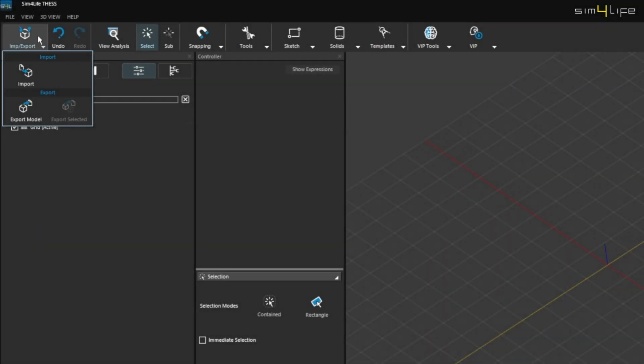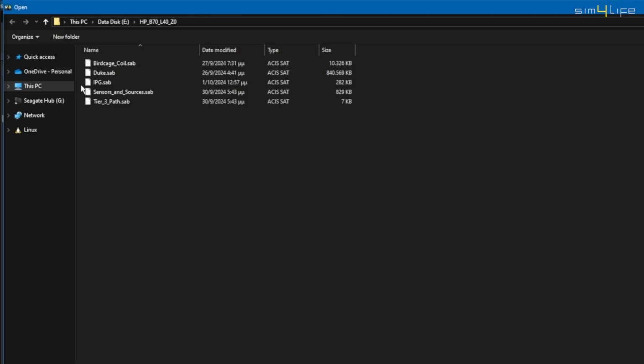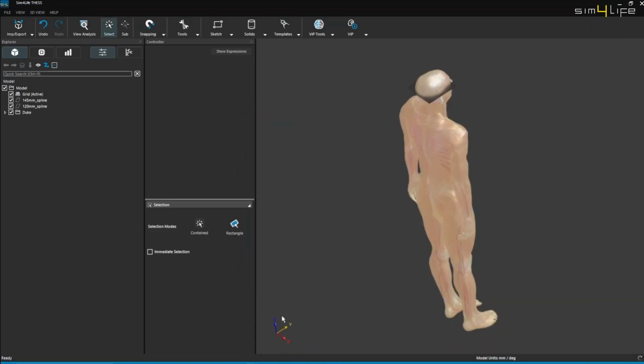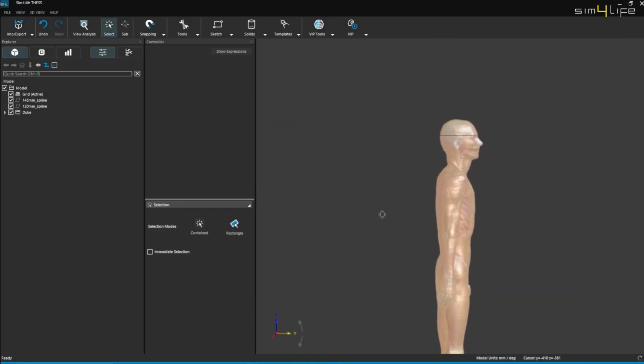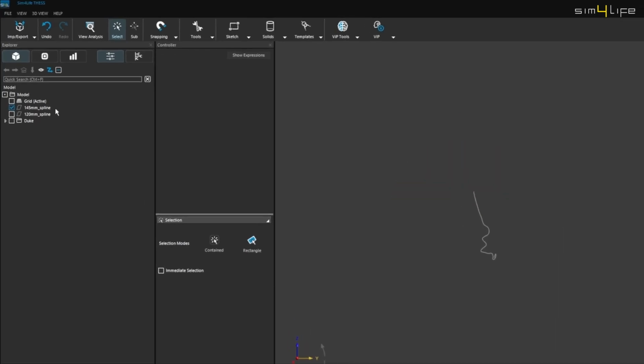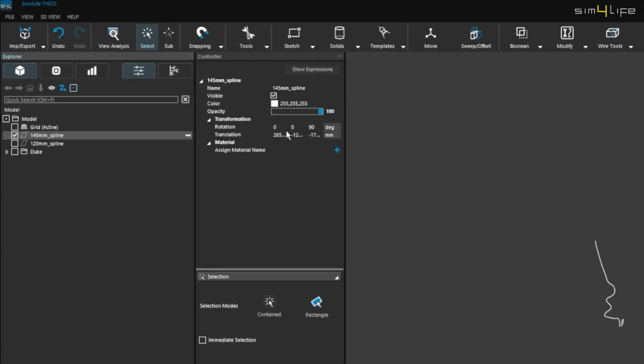We start in Sim4Life by importing the Duke model along with the lead path from the Tier 3 process. This path corresponds to a cochlear implant and, through the IMAnalytics module, was identified as the worst case scenario for the Duke model. We start by constructing the implant model.